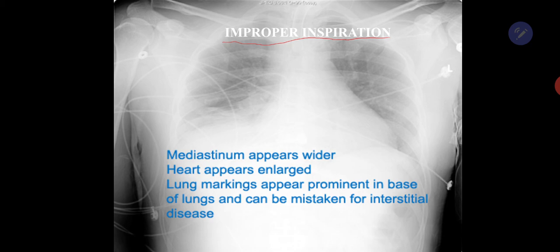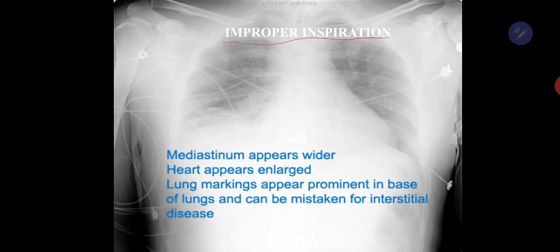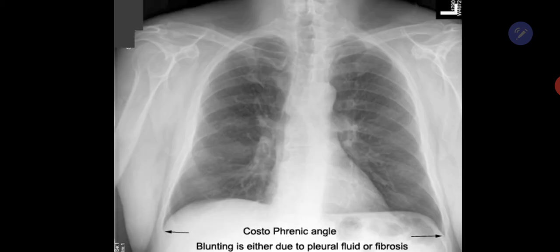So it is very important to know whether it was adequate inspiration or improper inspiration, or else we may misdiagnose a normal chest as an abnormal chest.